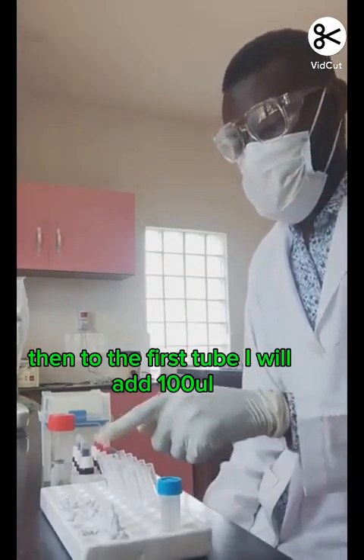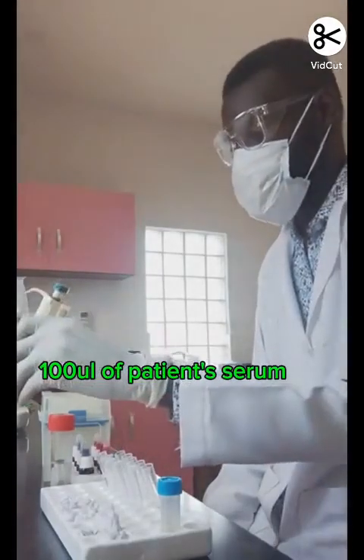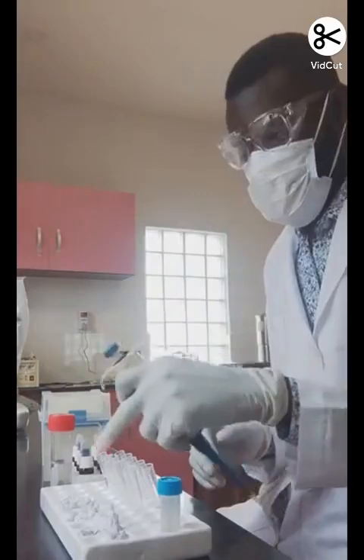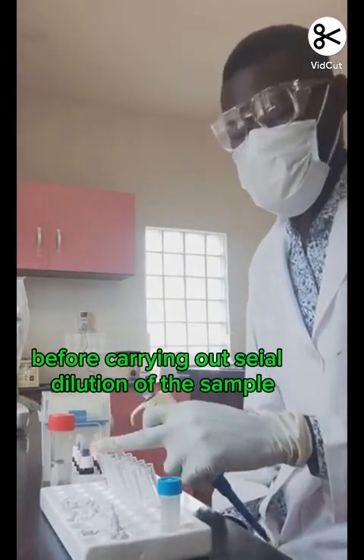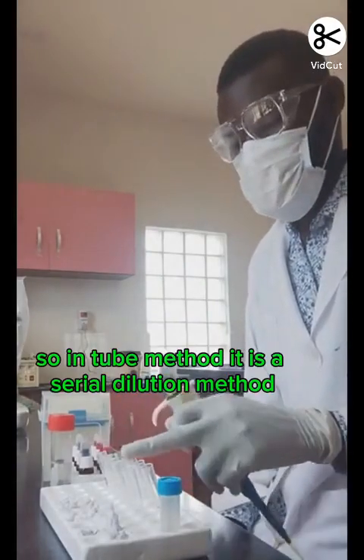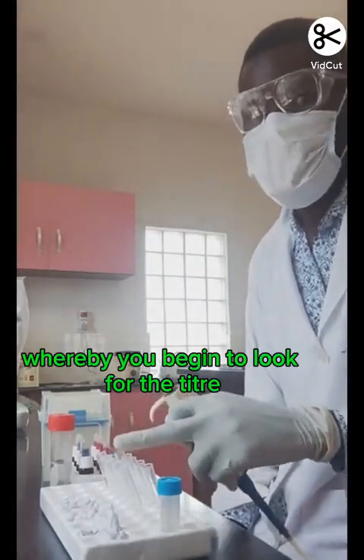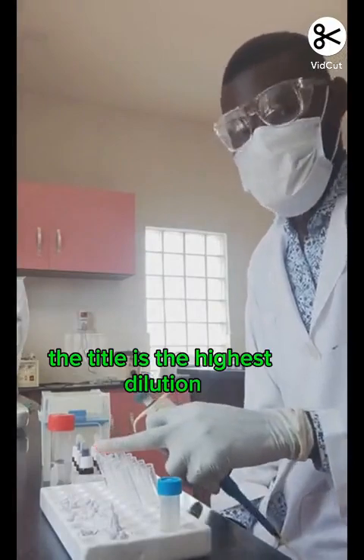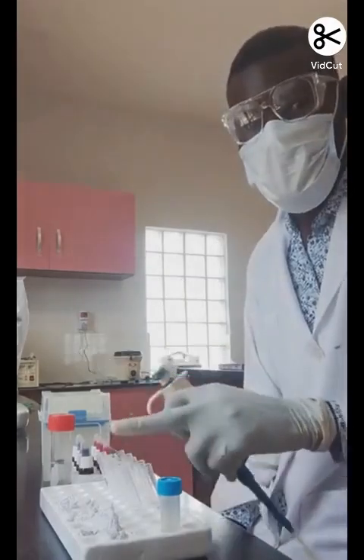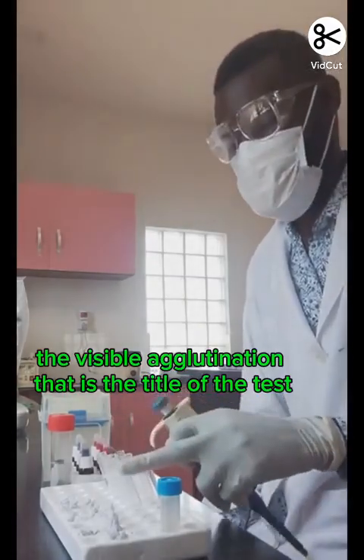Then to the first tube, I will add 100 microliter of patient serum. That will make it 2 ml before carrying out serial dilution of the sample. So the tube method is a serial dilution method whereby you look for the titer. The titer is the highest dilution whereby there is a visible agglutination. That is the titer of the test.